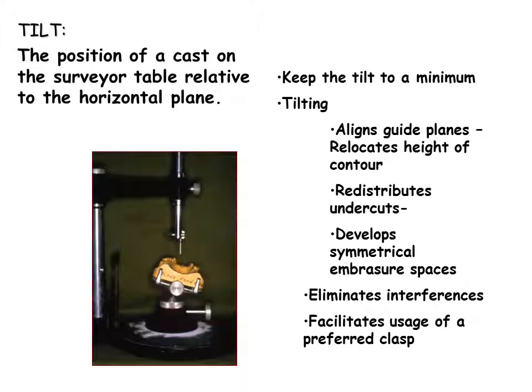A correctly trimmed cast is attached to the survey table. The base should be flat with no rocking, and the occlusal plane is level with the table — that is, at zero tilt. Tilting the cast anteriorly and posteriorly is performed until the most favorable alignment of potential guide planes is located. Bony protuberances and misaligned teeth are examined and noted. Areas of possible retention are analyzed. Lateral tipping may be used to relocate the undercut relative to the height of contour. By doing this, a preferred clasp may be employed. It should be noted that undercut cannot be created by tipping the cast.